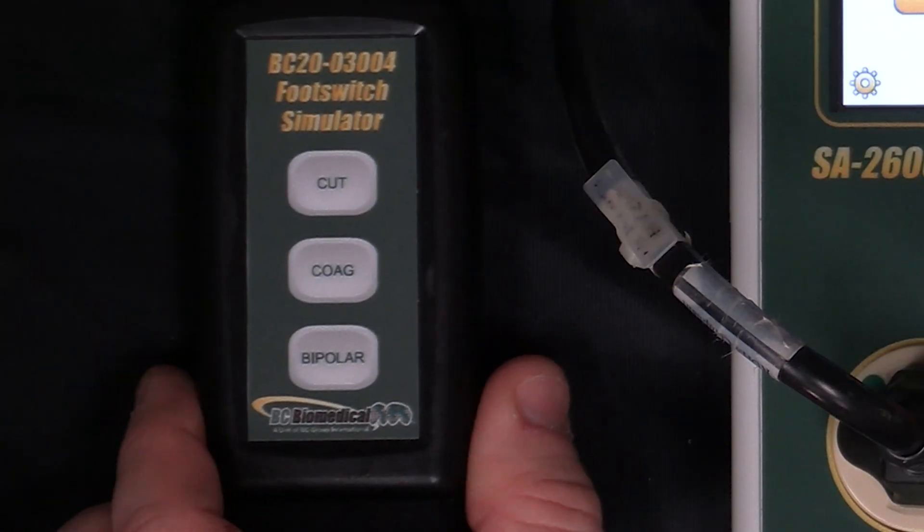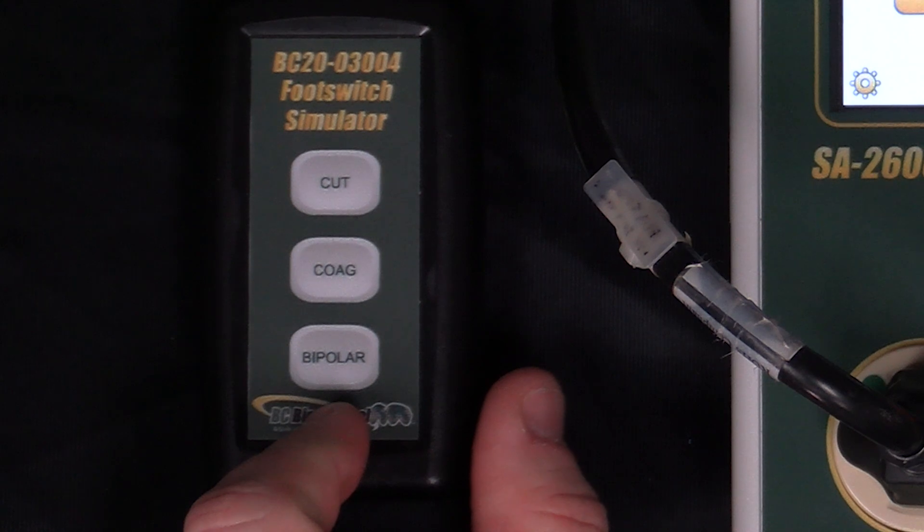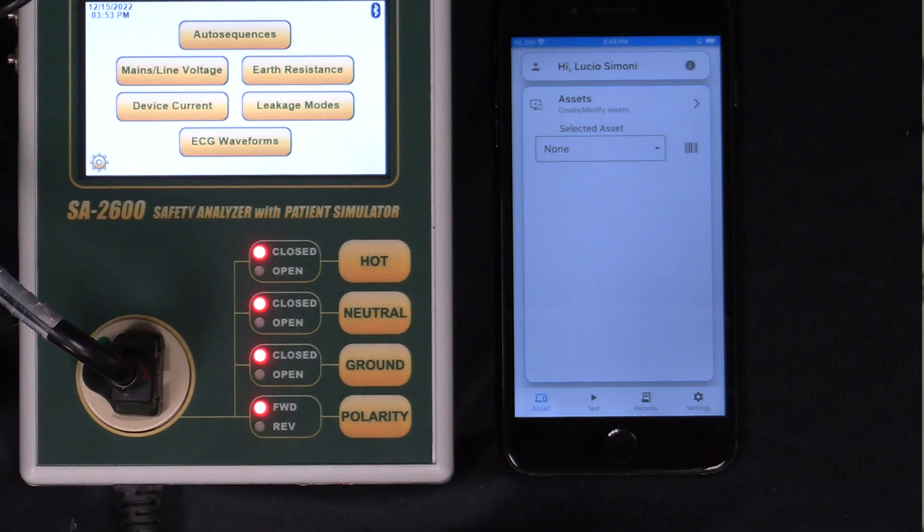I have a footswitch simulator so that I can trigger the output of my generator. And I have a phone running MyBC Mobile. This could either be an Apple or Android device. In this case we have an iPhone.